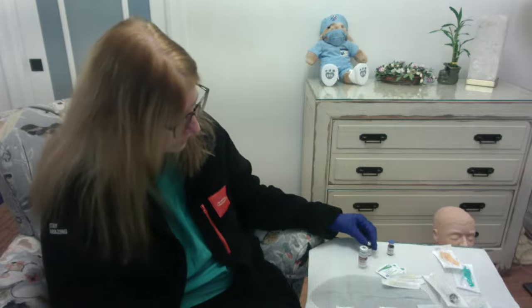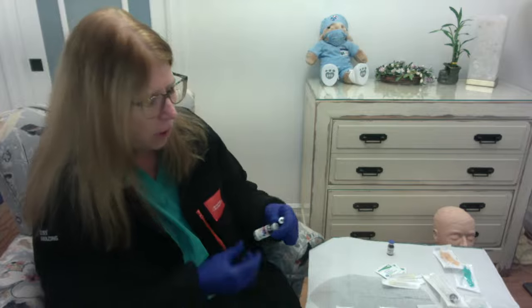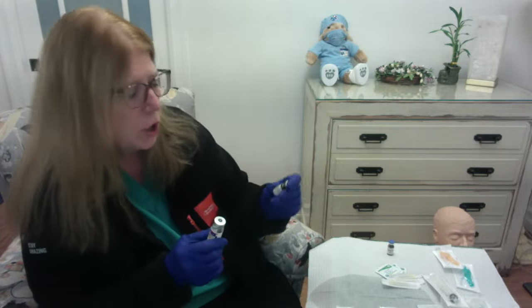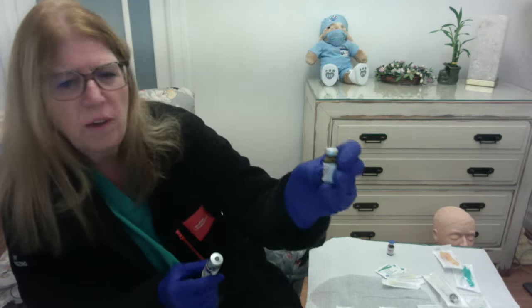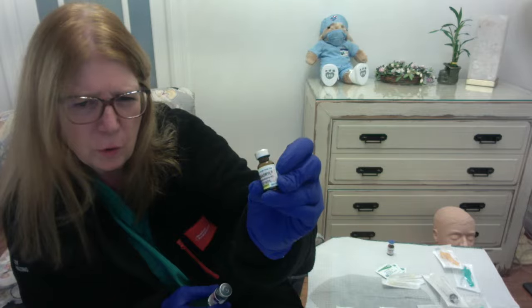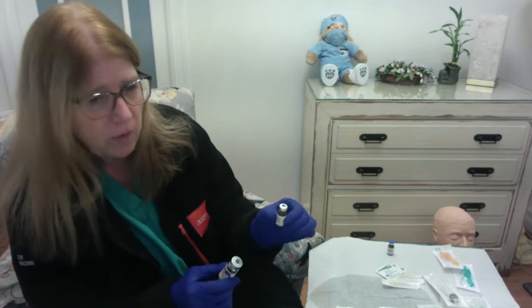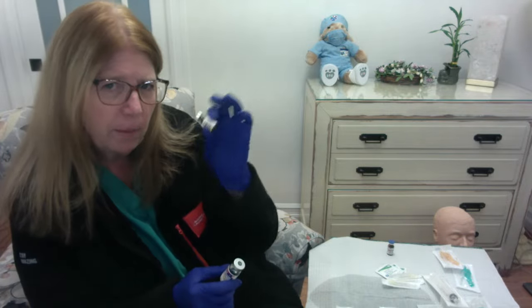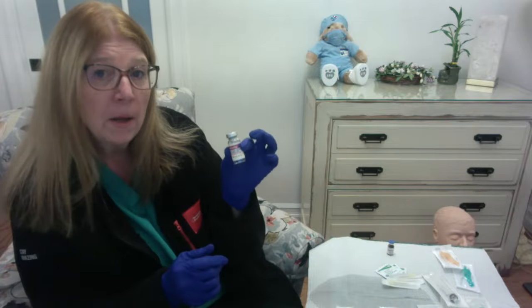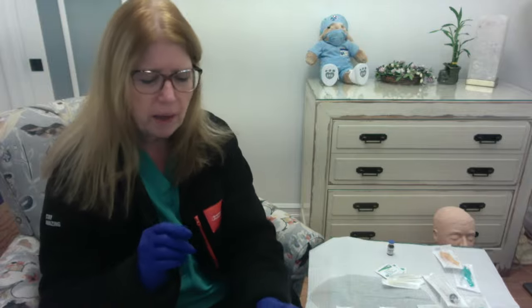So, as I said, some of the vials could be single dose and some of them can be multi-dose, and they will be labeled as such. So if they are a single dose vial, I don't know if you can see that, but you'll see it in the lab. Right on the top it says single dose vial. So even if I don't use the whole thing, I'm getting rid of this vial. I'm not saving it to give the rest of the medicine to some other patient. Our insulin vials, however, are multi-dose vials. This one is.